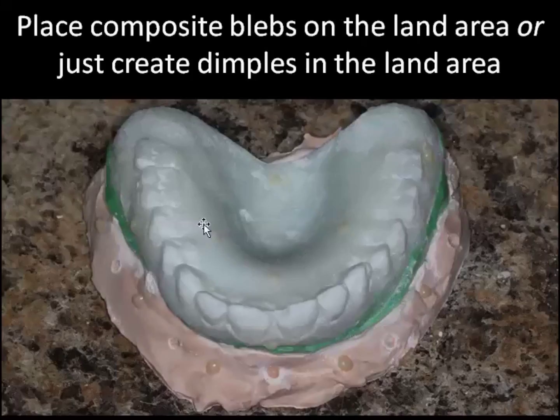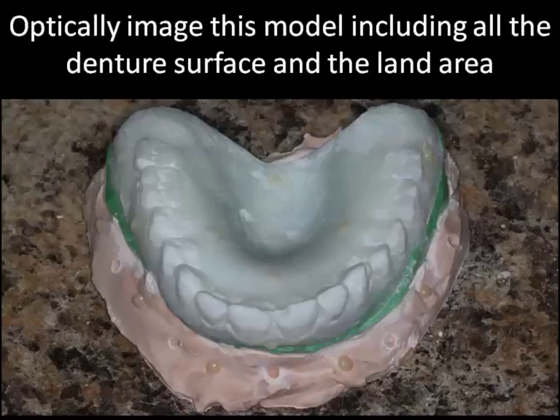These blebs are going to be the markers used as a bridge to get the STL model merged correctly. As you can see here, we've got our composite blebs on the denture and composite blebs on the land area of the cast. Before separating this model you need to go ahead and optically image this model to include all of the denture surface and all of the land area. It's very important that you pick up all of these markers.